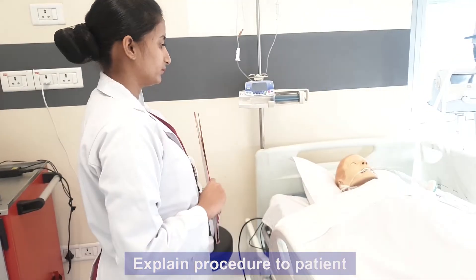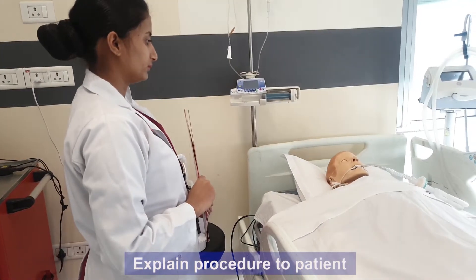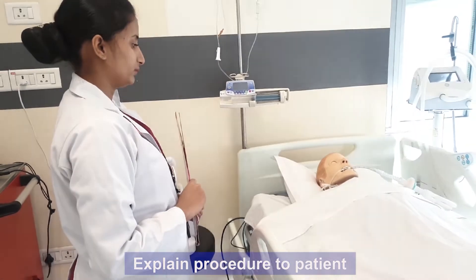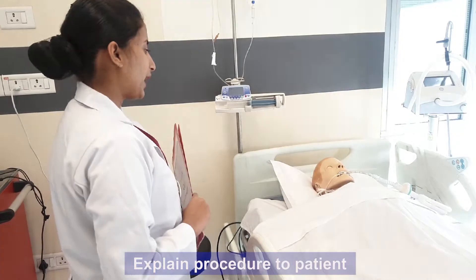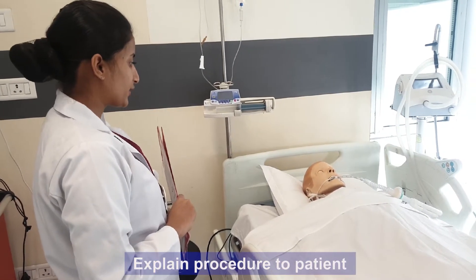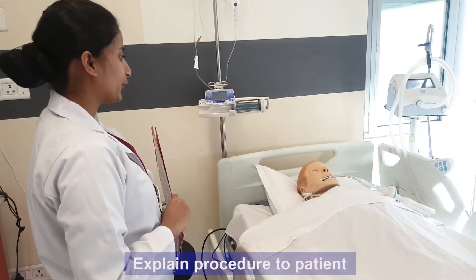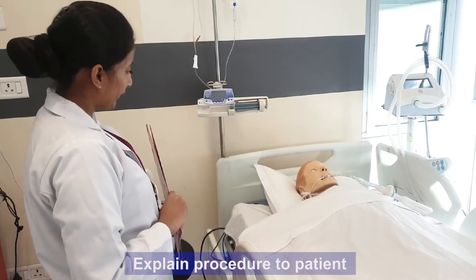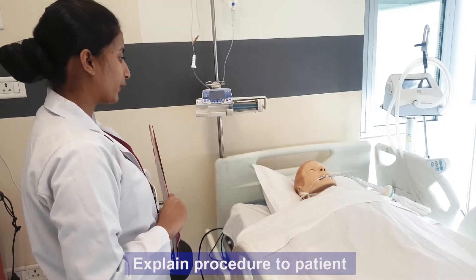Even if the patient is unconscious, explain the procedure to the patient as the subconscious mind of the patient is awake. Sir, I have to perform suctioning as per the doctor's order such that your airway will be cleared and you will not be having any breathing difficulty. I will arrange my articles and will come back within a few minutes.